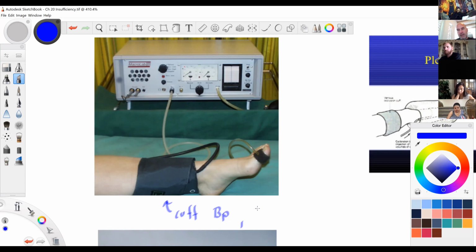But what if we squeeze the cuff, in air plethysmography, to only 10 millimeters of mercury? That's nothing. That's a snug little feel. 10 millimeters of mercury, and we have very sensitive equipment to look at that. So obviously, where's the cuff? Well, this person has a toe cuff. All right, we'll talk about the toe cuff then. It doesn't matter, it's the same difference.